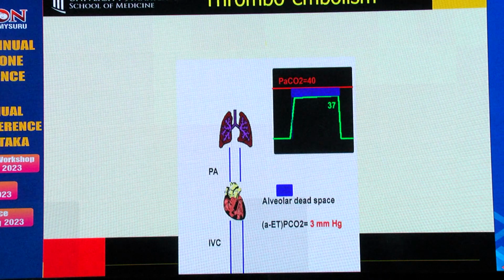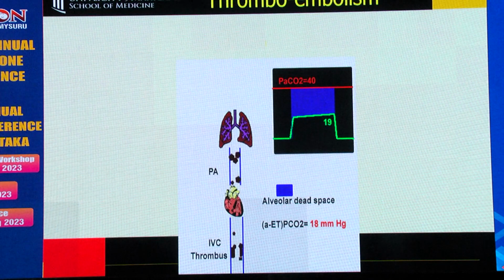And this is where, as the previous speaker said, the end-tidal CO2 fell. They put in a probe, and the patient had a pulmonary embolism. So instead of having hip surgery, the patient had a sternotomy and removal of the embolus, and the subsequent surgery was done 3 or 4 weeks later. So what I'm trying to say is end-tidal CO2 is a very powerful tool.